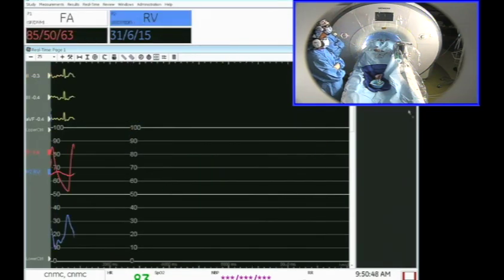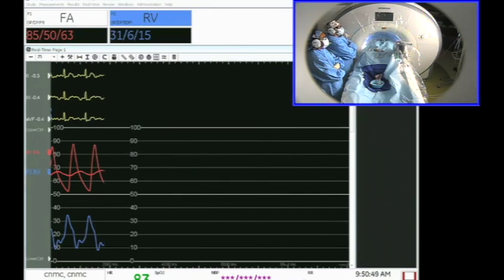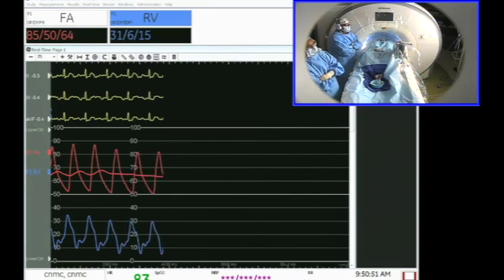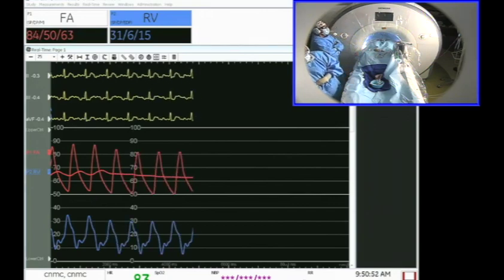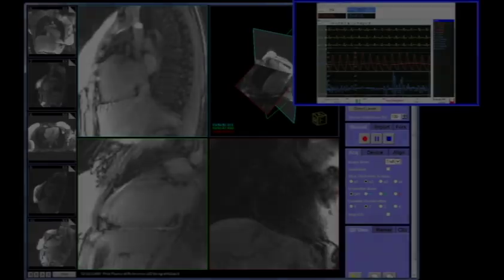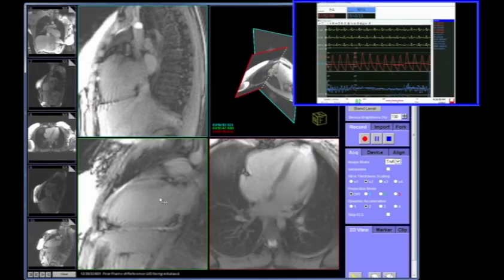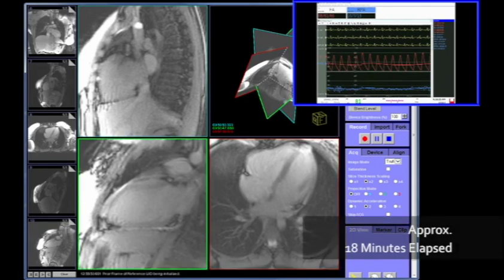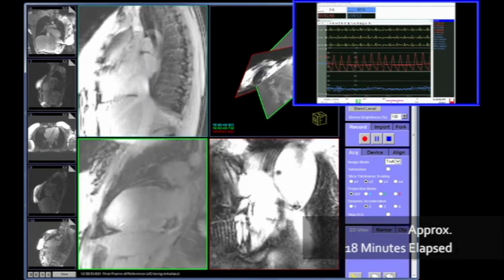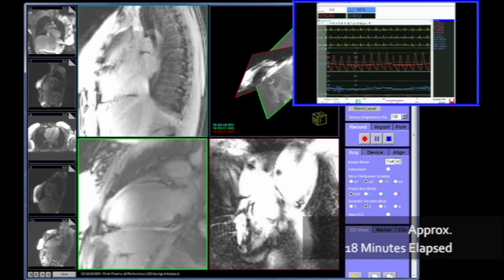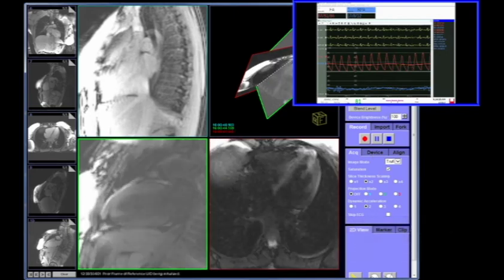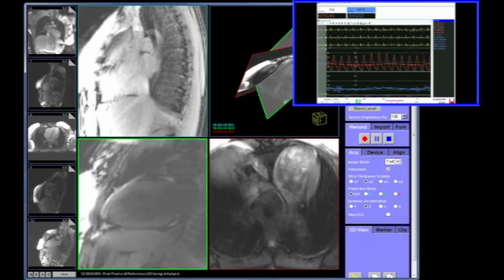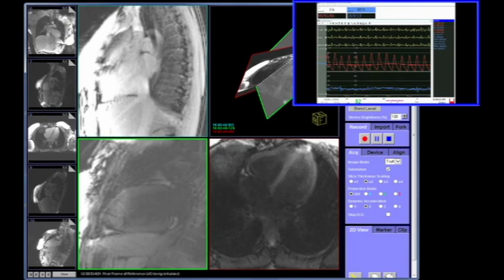She has a normal right ventricular pressure, as expected for a healthy 17-year-old. Show me EDV, a two-chamber view on the lower left, and a four-chamber view on the lower right. The defect in this case, for the audience, is known to be right in the middle of the interatrial septum — a moderate atrial septal defect, about 10 millimeters.